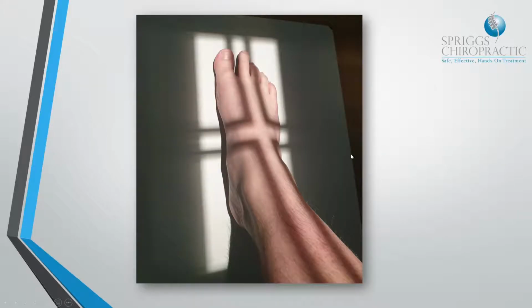This is how you set the patient up: the central ray is at the base of the second metatarsal. So somewhere around here is going to be your midpoint, or your central ray, running up the second metatarsal. As you can see, the overlying anatomy of the ankle is going to obscure your view of the main body of the calcaneus, and the body of the talus is also going to be difficult to evaluate with this projection. However, you can still see the navicular, the anterior aspect of the talus, and you may also be able to see the anterior aspect of the calcaneus.